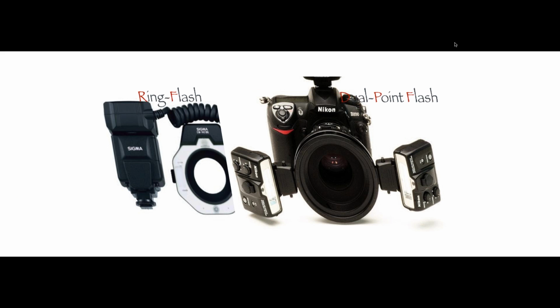Well, the answer to that question is basically, if you are a new photographer, that means that you are just getting into dental photography. You're just getting started. And obviously, you want to start out with spending the least amount of money possible, so that you can buy the equipment and start taking photos. I would highly recommend that you buy a ring flash.